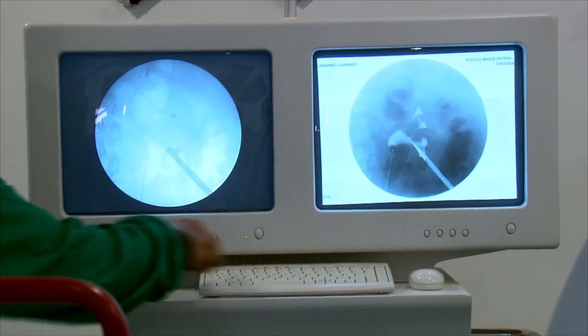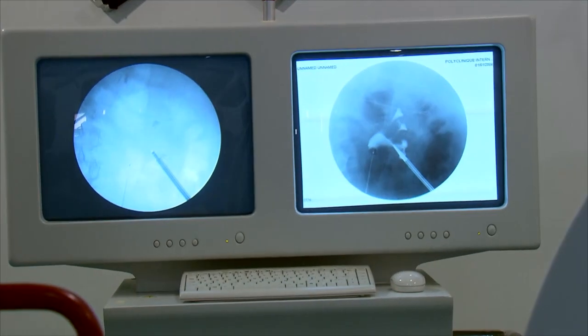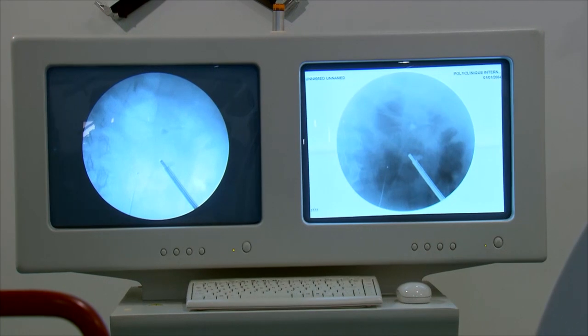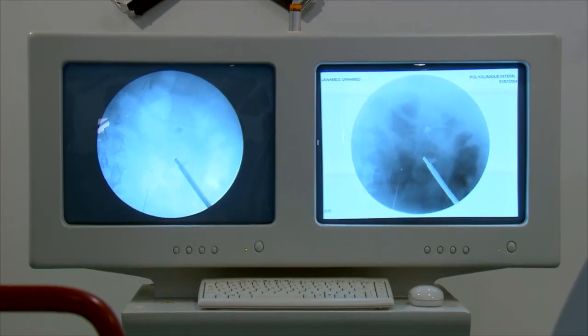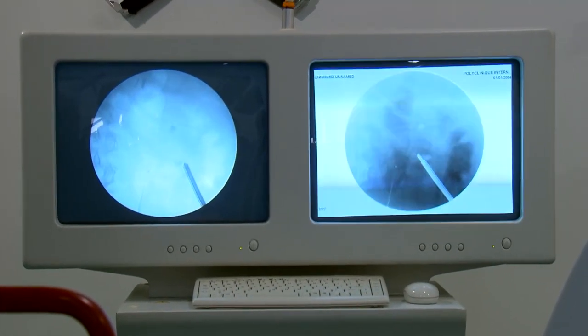X-ray, please. Stop. Yes, we see clearly. There is an upper calyx stone. Yes, a fragment. X-ray, and X-ray, please. Stop. Yes.